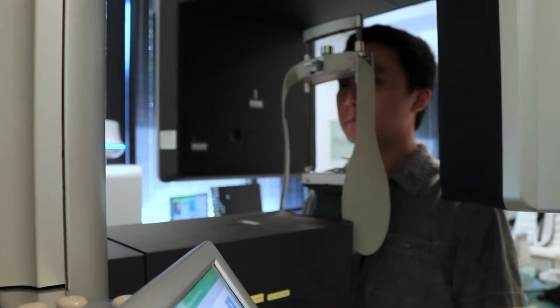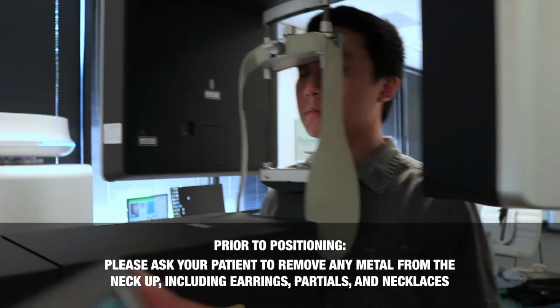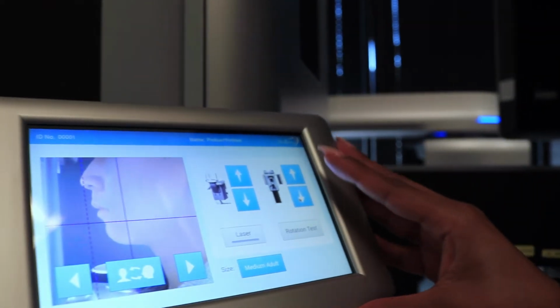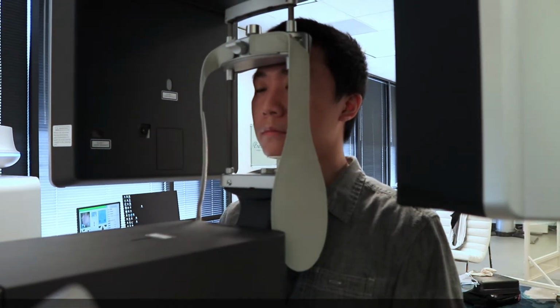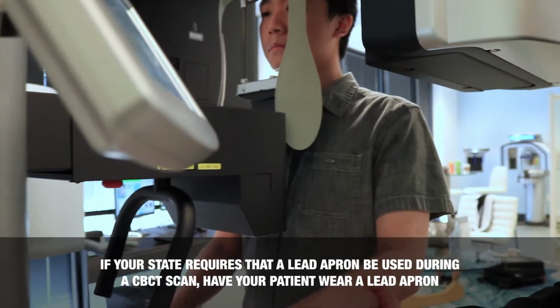Have the patient stand facing the unit. On the LCD screen, use the gantry arrows on the far right of the screen to raise or lower the machine to the height of the patient's chin. Ask the patient to rest their chin on the chin rest and guide their hands over to the handlebars.